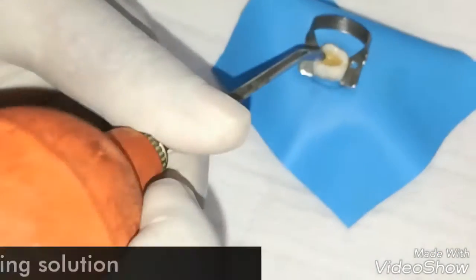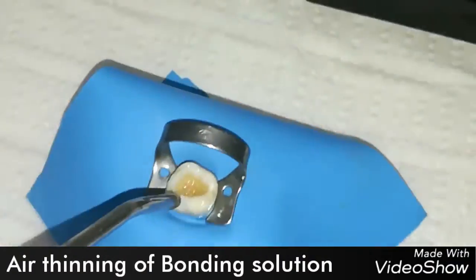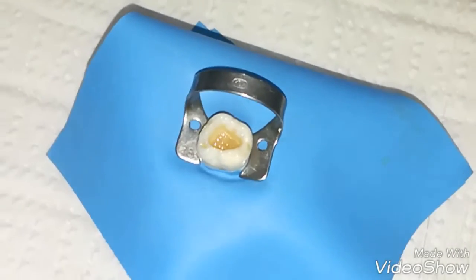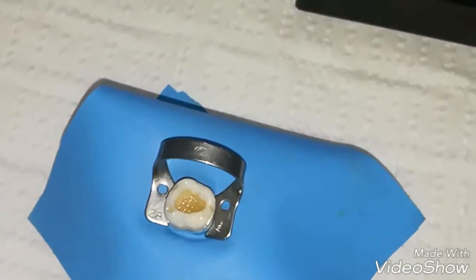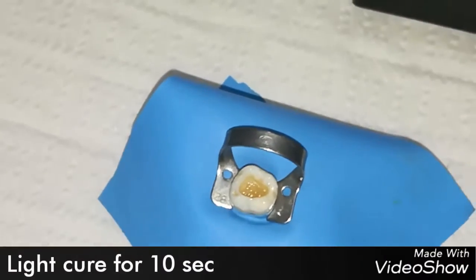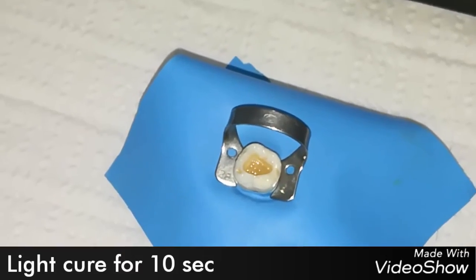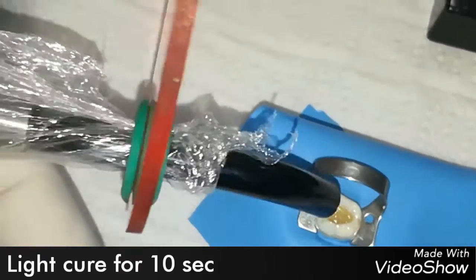We use some air to thin the bonding material, then cure for 10 seconds.